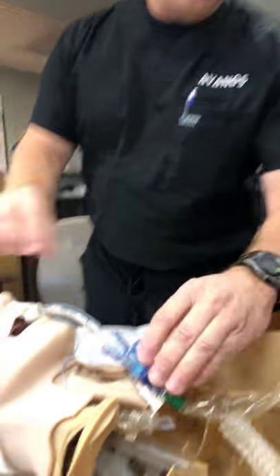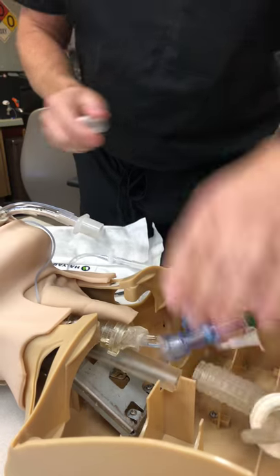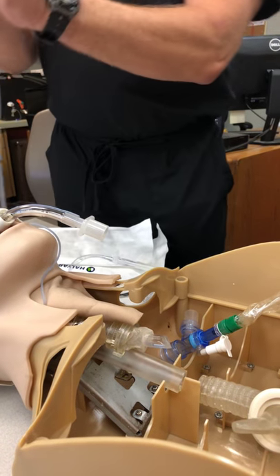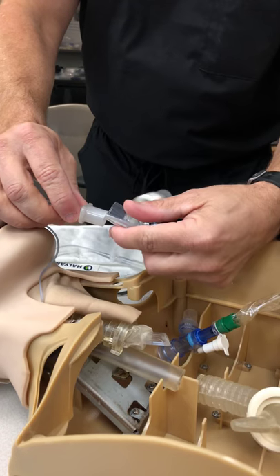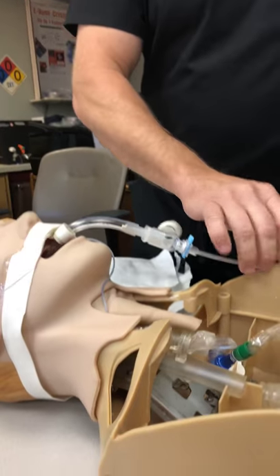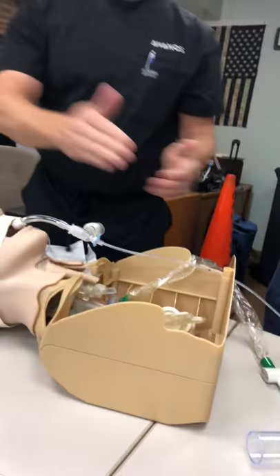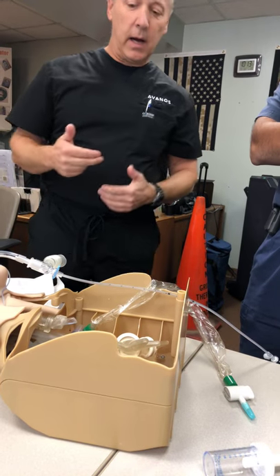From there, we would go ahead and disconnect our closed suction, disconnect our vent tube, connect it to our elbow, and then we would go ahead and insert it like that. Now we're in-line to go ahead and start advancing our mini-BAL to get into the right or left side of the lung.